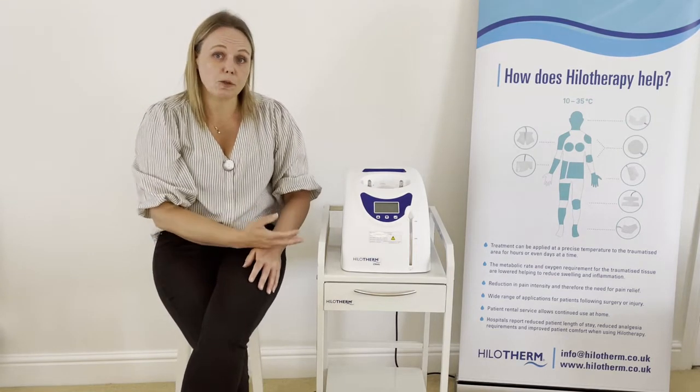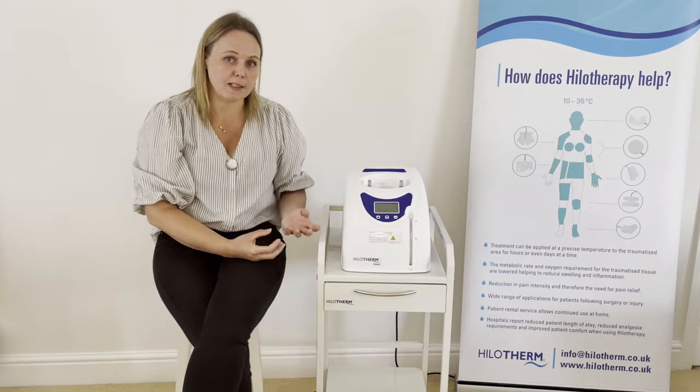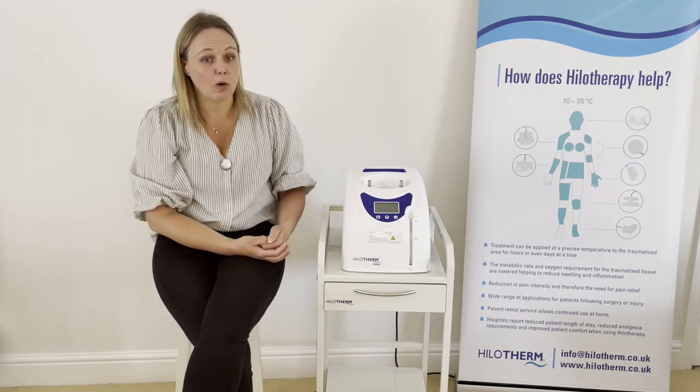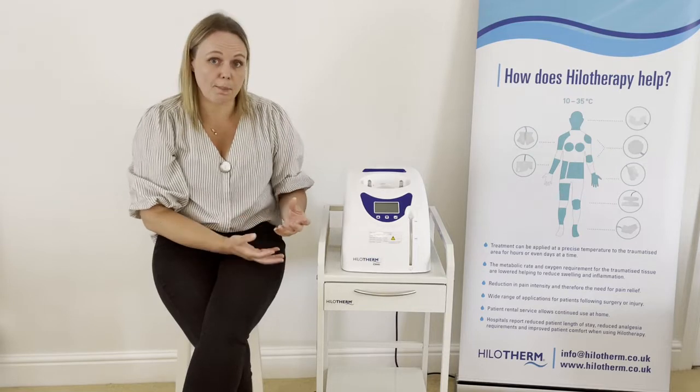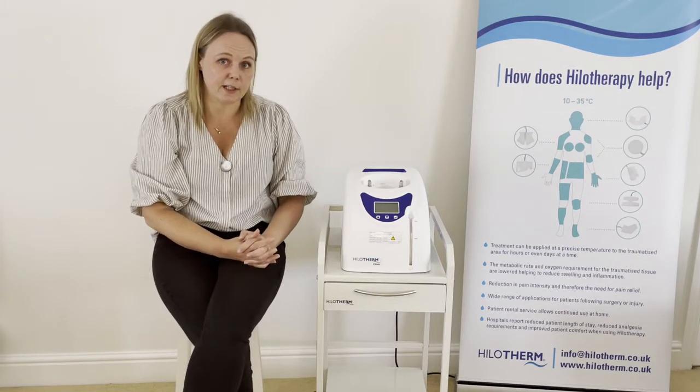For facial surgery, be it cosmetic or jaw surgery, we would normally recommend a temperature range of between 16 and 19 degrees. For the knee or the foot and ankle, which is an extremity, we would recommend between 15 and 18 degrees C.